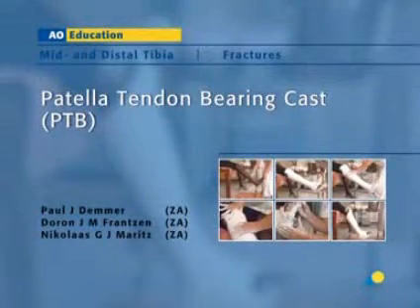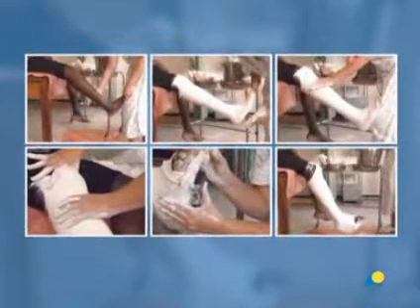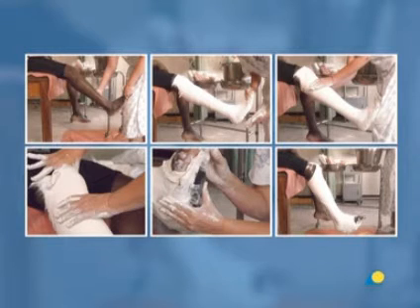The patella tendon bearing cast, or PTB, is usually applied as the last stage of treatment for tibial fractures. The pressure applied to the fracture site as the patient walks stimulates bone growth. The PTB may also be used for rehabilitation of the knee for a patient whose leg has been immobilized by a long leg cast.